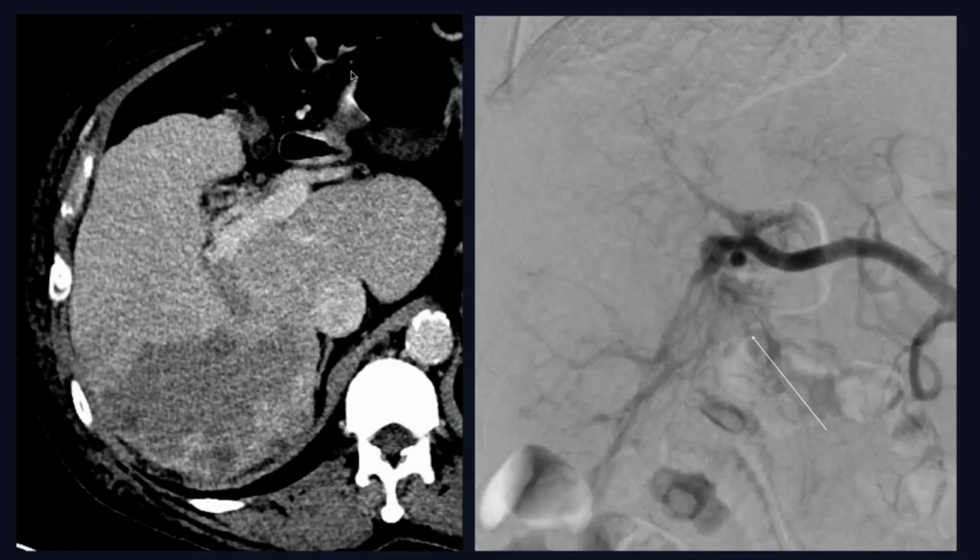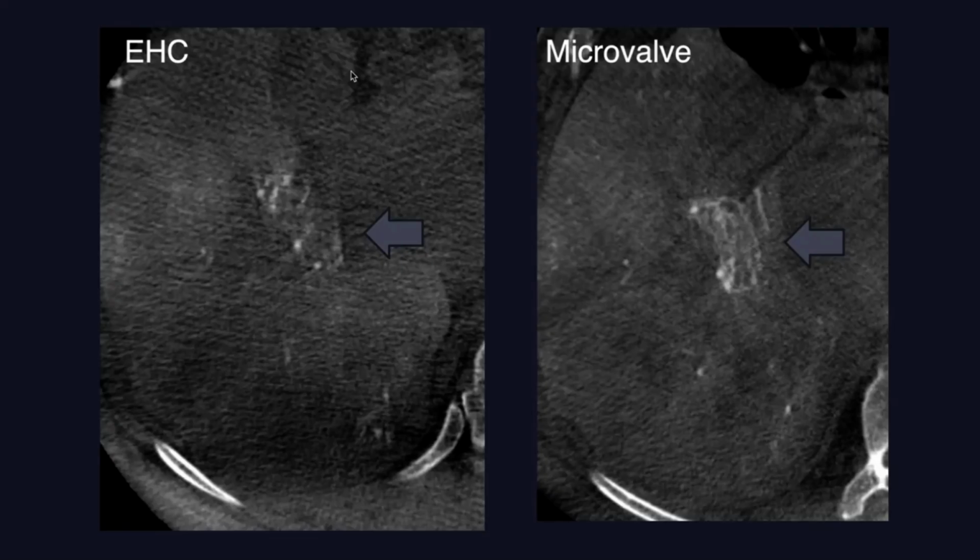Here's the angiogram, and you can see on the angiogram the threads and streaks, the classic angiographic appearance of tumor vascular invasion. For these cases, I always start off with a traditional cone beam CT with an end-hole catheter. That's what I did.